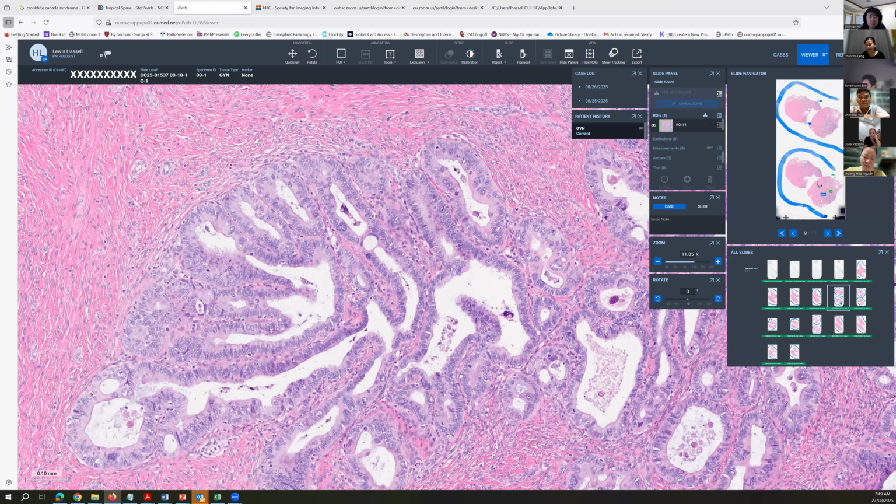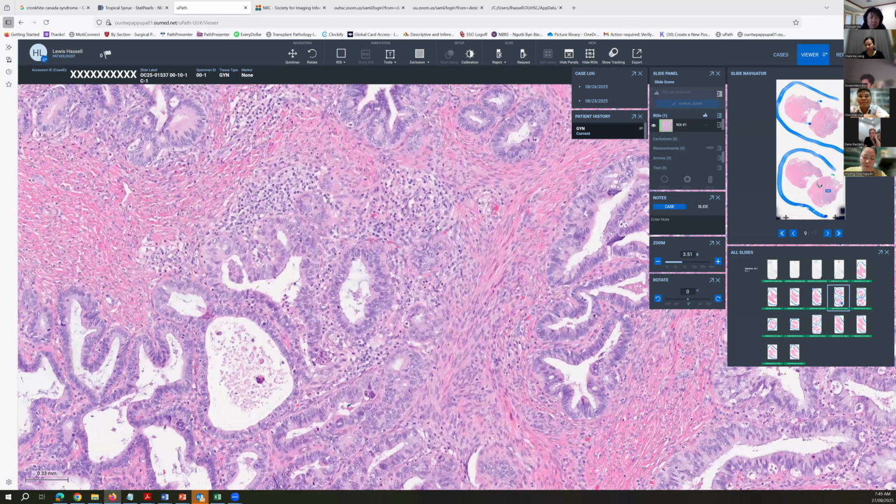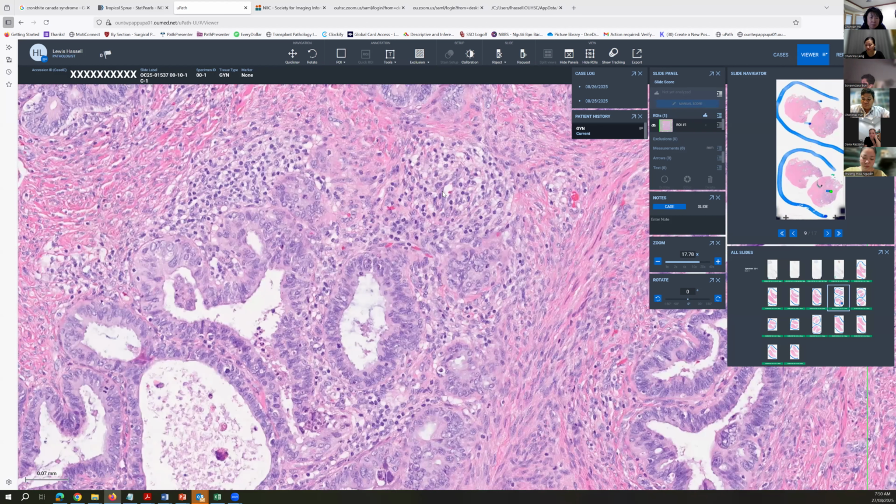Whereas B-type invasion will have some of that, but will also have some areas where you get a degree of this sort of change. You get some inflammatory reaction, maybe a little bit of stromal change associated with that type of disease, angulated, incomplete glands, and things like that.